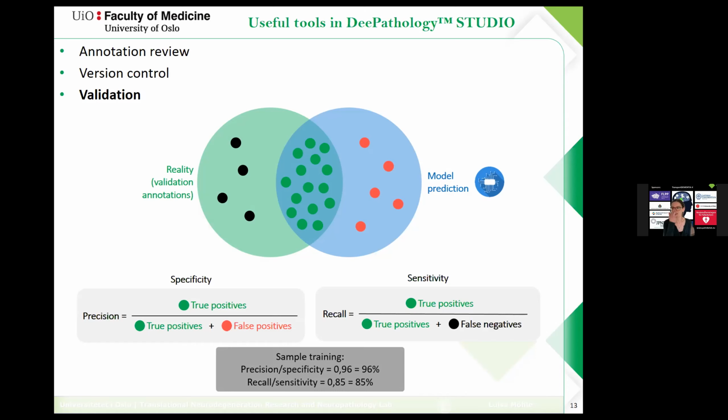And just for fun, I ran this also over the little algorithm that I created in the video for demonstration purposes. And already after a relatively short amount of time, we had a specificity of 96% and sensitivity of 85%.